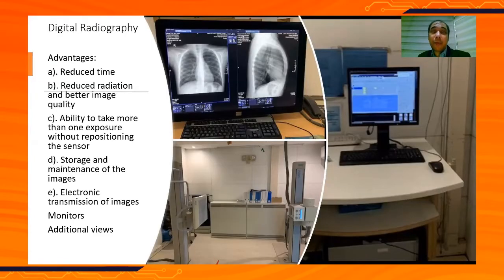So the primary requirement of panel sites is digital radiography. This technique uses X-ray sensitive plates to capture data during examination, which is immediately transferred to a computer without the use of an intermediate cassette. So it basically removes the requirement of darkroom procedure.